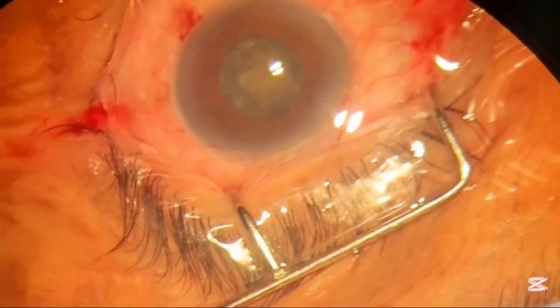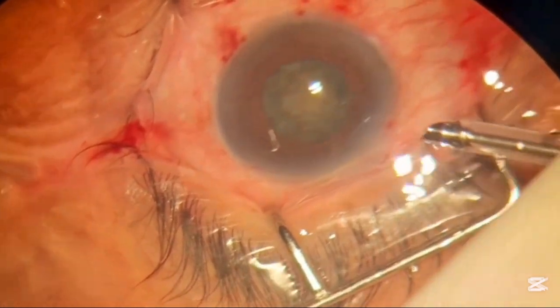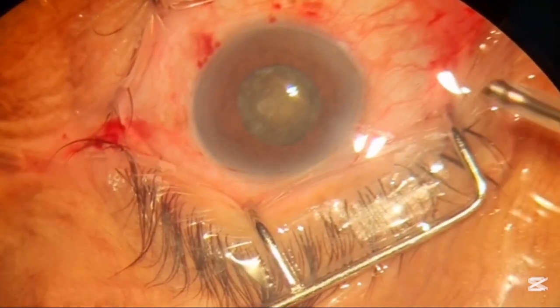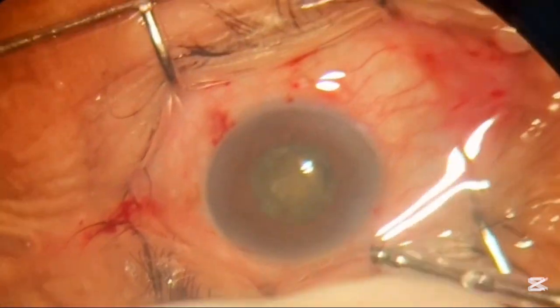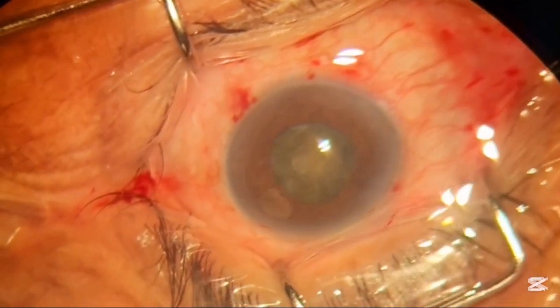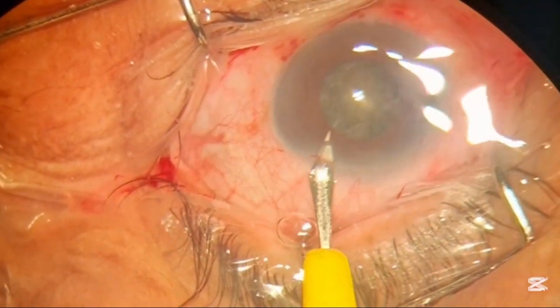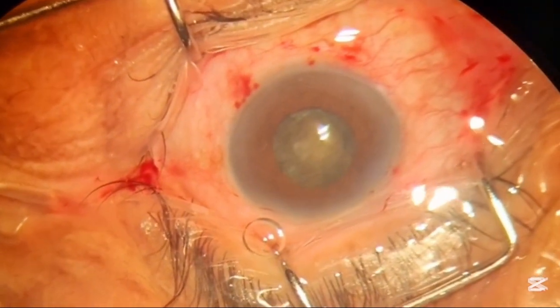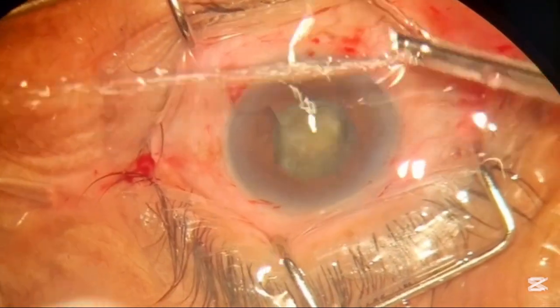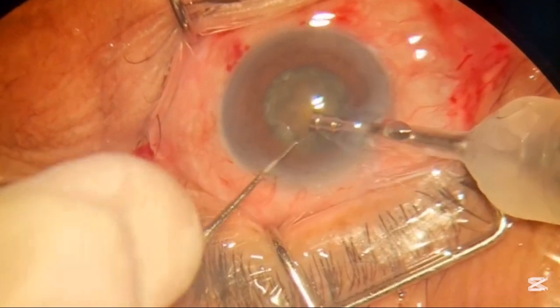Now after displacing the nucleus we will perform the FACO emulsification procedure. This is the FACO handpiece with the FACO tip, on which a sleeve is present covering the FACO tip. There is also a small entry port for the second instrument, which is the dialer or chopper. We use the dialer in our surgery.